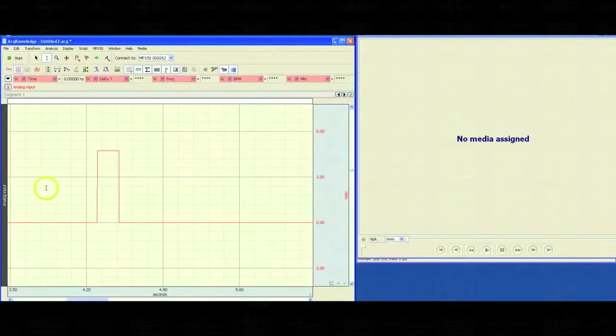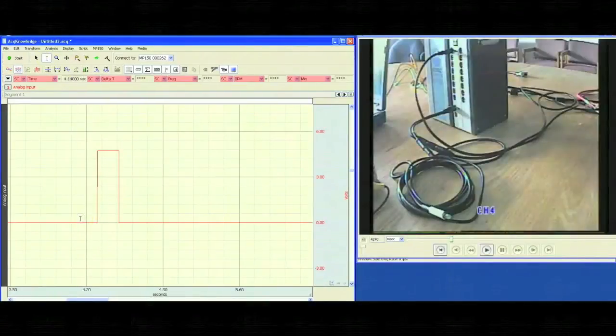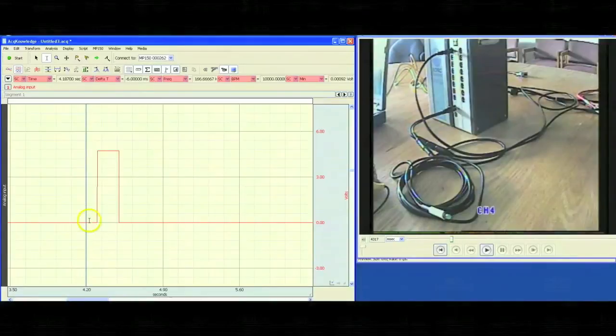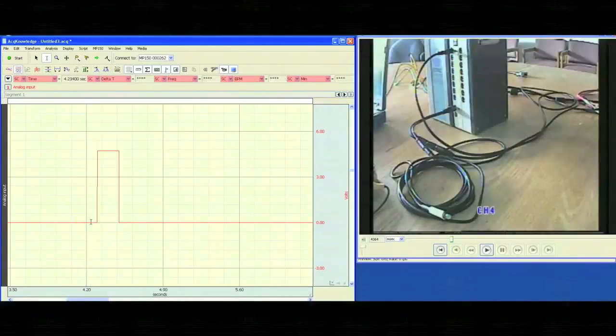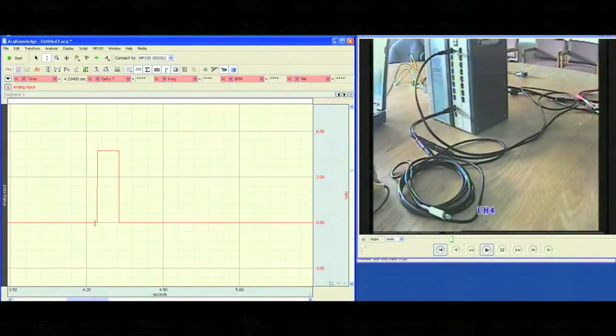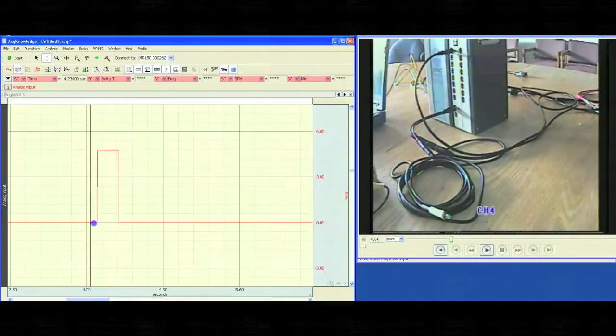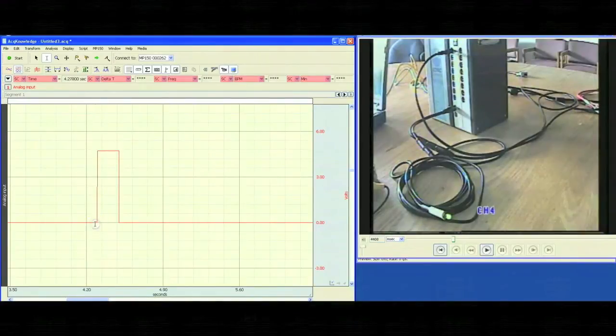Now, what we can do is click in our file, and you'll see as I'm selecting data points within our file, it's showing me the corresponding video frame. What I'm looking for is where on the video the light is flashing.